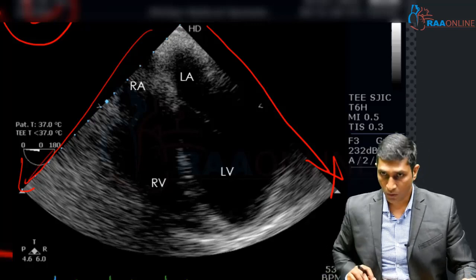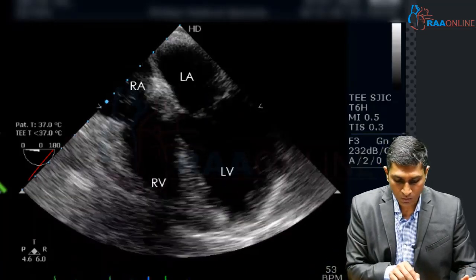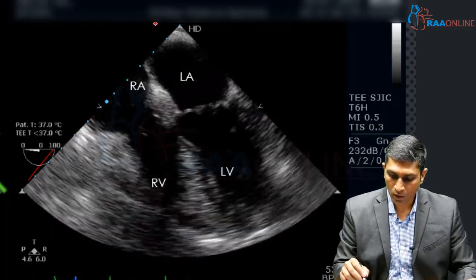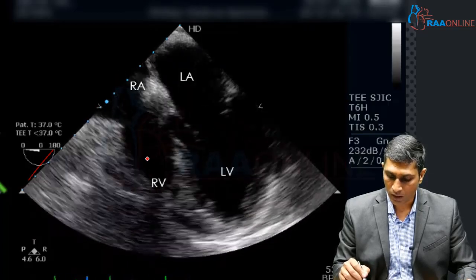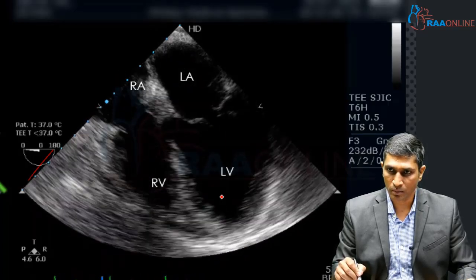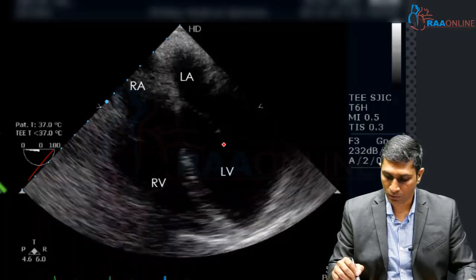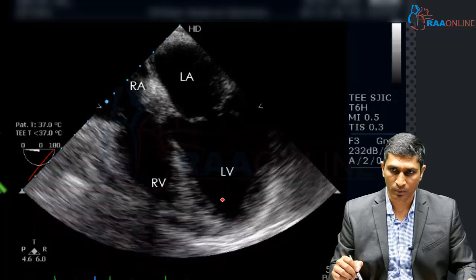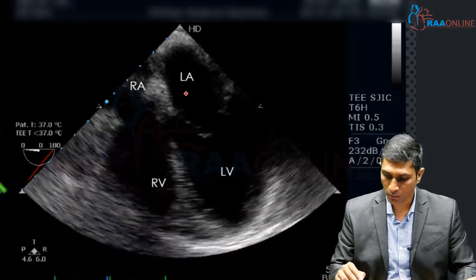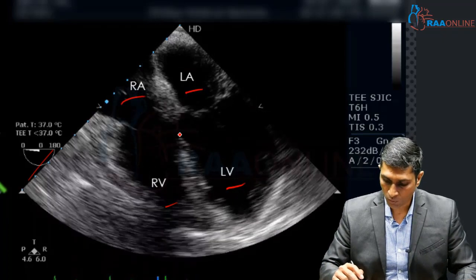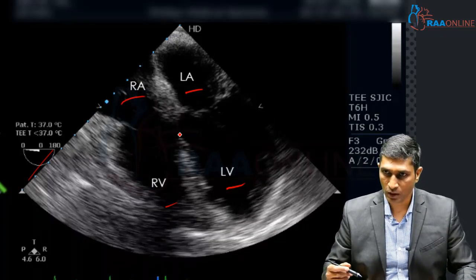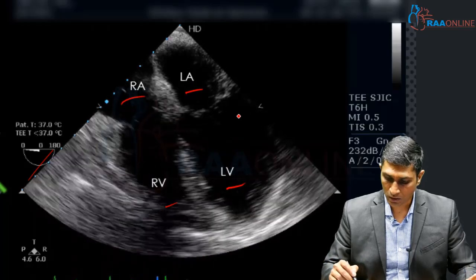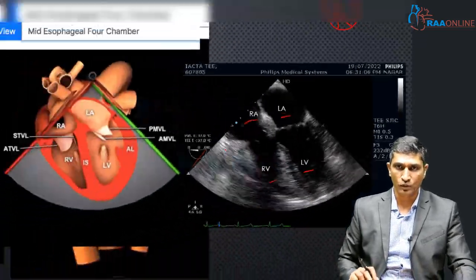The mid esophageal four chamber view shows all four chambers of the heart. On the left side of the image, we have the right atrium and right ventricle; on the right side, we have the left atrium and left ventricle. The interposing valve between the left atrium and left ventricle is the mitral valve, along with the tricuspid valve, the interatrial septum, and the interventricular septum. This view allows assessment of regional wall motion abnormality, measurement of volumes, intracardiac masses, mitral regurgitation, and tricuspid regurgitation.